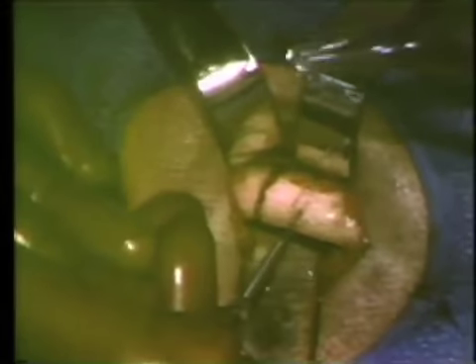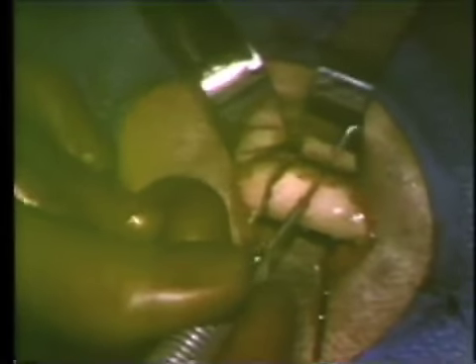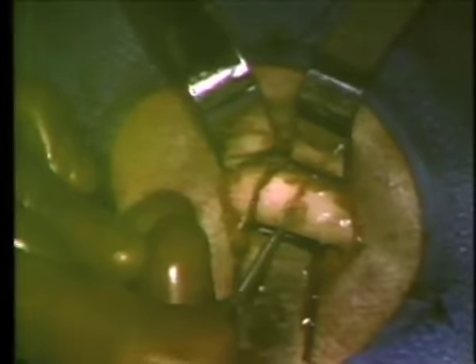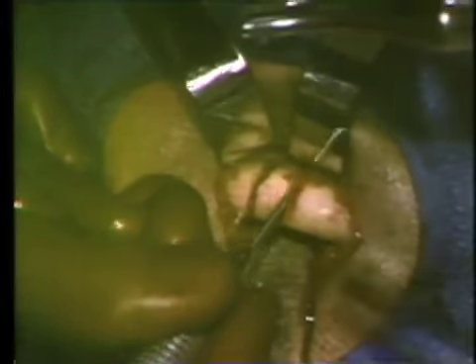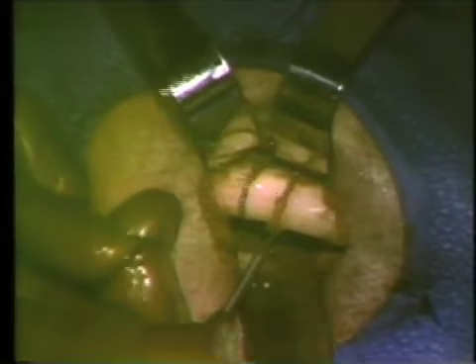And because there is some slack or excess in those structures when this segment is moved backward, an effort is made to accommodate for that extra material by countersinking and removing some of the bone from the immediate vicinity of the canal and the adjacent fragments, so that it will not be compressed and pinched off as the retrusion is made in the operation. The cortical bone at the inferior border of the mandible is exceedingly dense, and we'll be cutting through that.